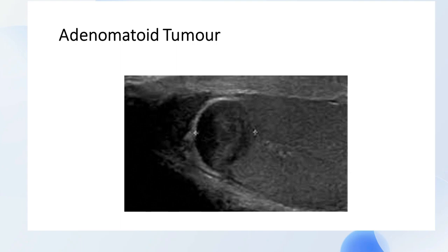Okay, so this is another example of an extratesticular tumor. Here you can see it can be found in the epididymis. So these lesions, which are regular in outline, can be what are called adenomatoid tumors, which are benign extra testicular tissue. They can also occur inside the testicle, but you need to have a biopsy to differentiate a malignant transformation from this adenomatoid benign lesion.